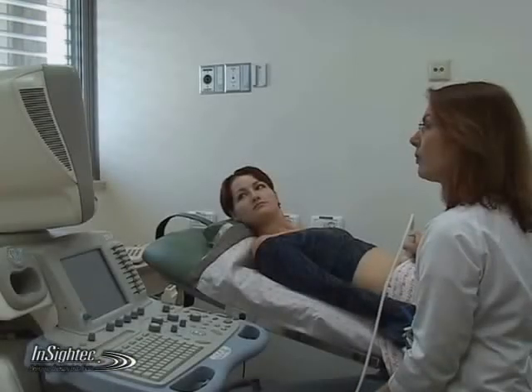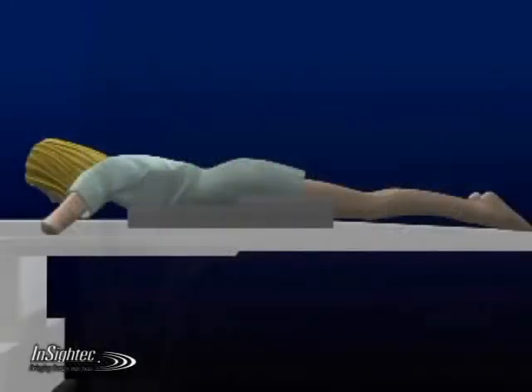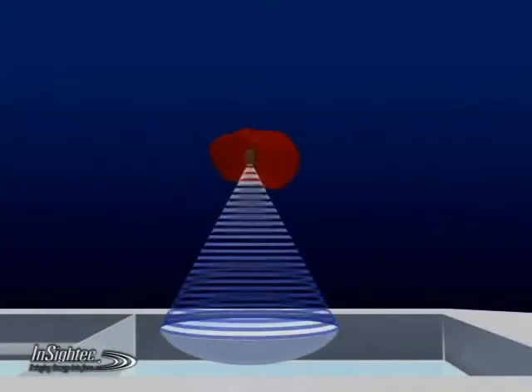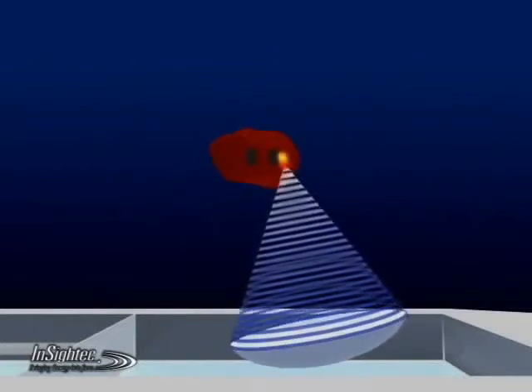Ultrasound imaging is a widely accepted diagnostic tool. Now, this energy source is being investigated as a therapeutic tool as well. Focused ultrasound delivers thermal energy with ultrasound waves focused on a single point. A high-intensity ultrasonic beam, called sonication, passes through soft tissue and focuses on a targeted location, causing localized high temperatures of 65 to 85 degrees Celsius without affecting surrounding tissue.